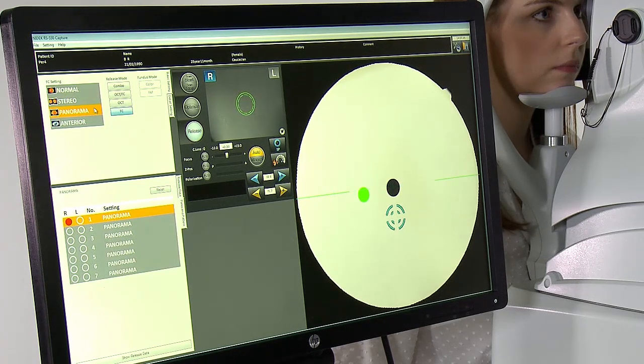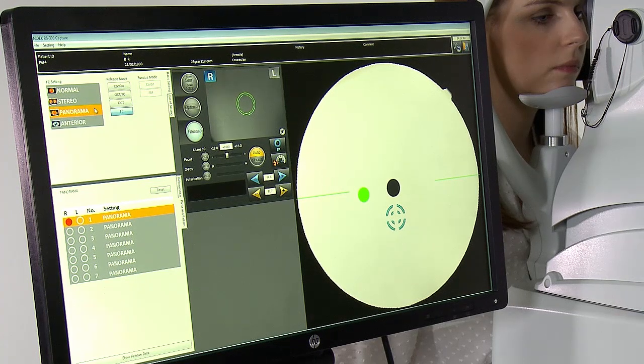In those circumstances, I would recommend dilation, but it will take 7 images around fixation points, which will give you a large stitched together photograph going beyond 60 degrees field of view. And the image software, the image wizard, allows you to stitch those together quite easily. As well as fundus photography, you can of course do anterior photography too, which we'll do in a moment.